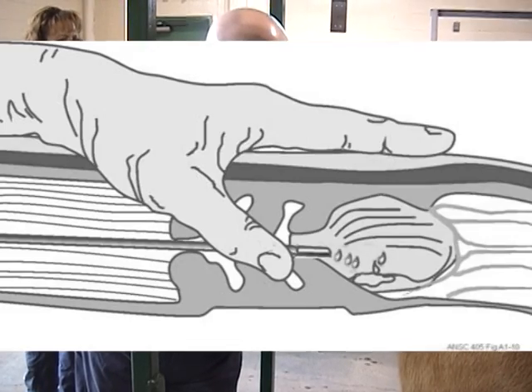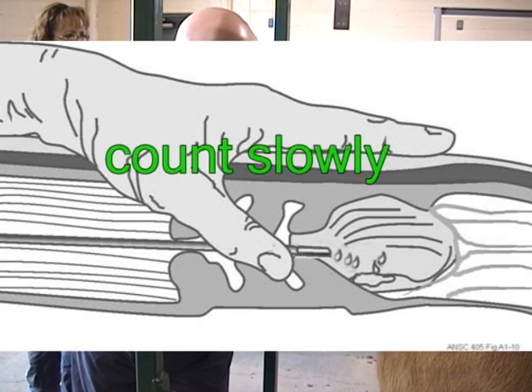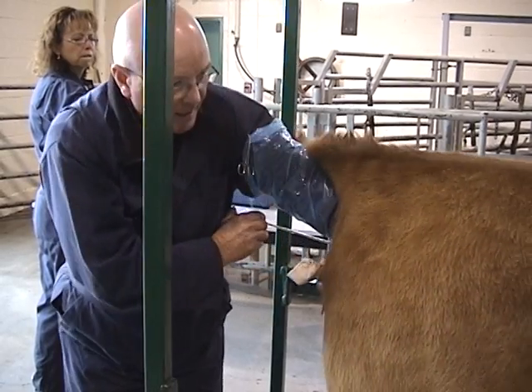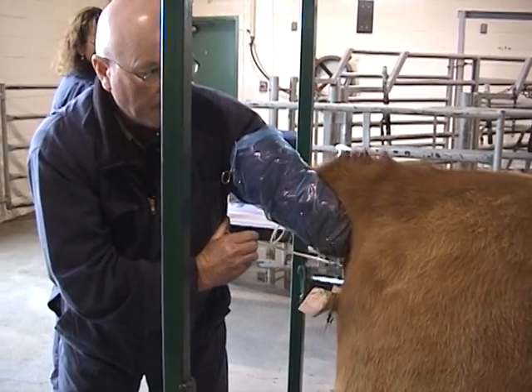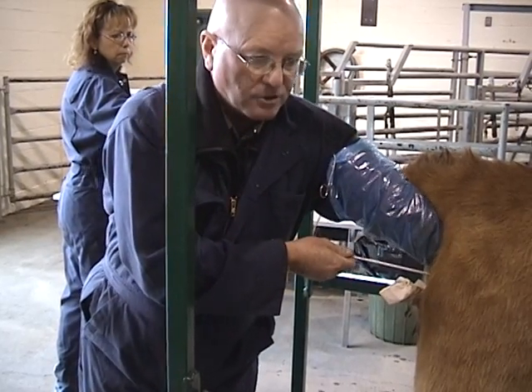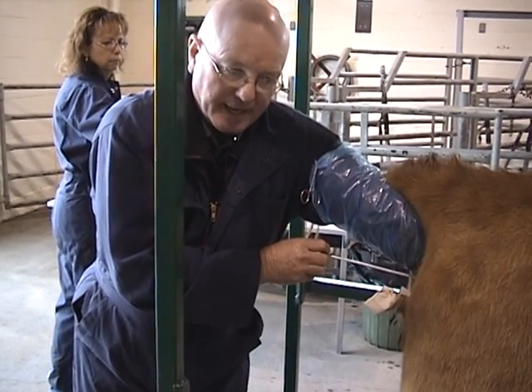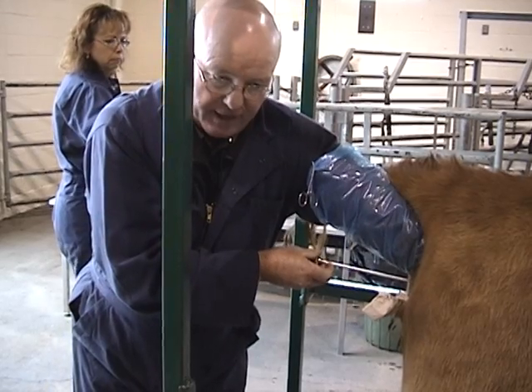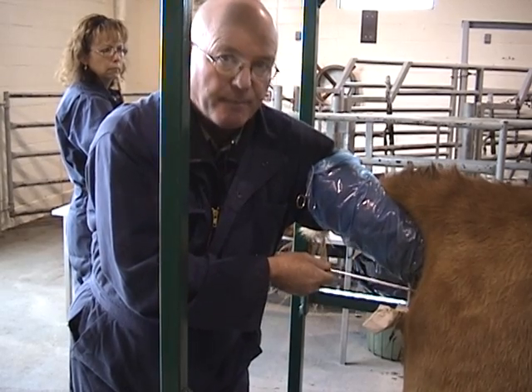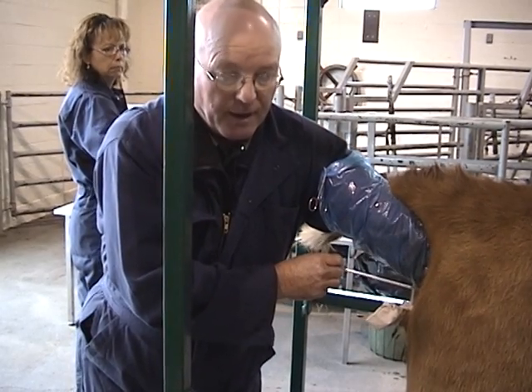I'm now going to inseminate — inoculate the semen into the body of the uterus. As you're inoculating, you want to count between five and seven. You want a slow, steady, even deposition of semen into the uterine body. If she kicks, belches, or shifts position as you're depressing the plunger, stop, stay with her, lean against her, let her settle back down, and then re-identify your rod tip. If you don't re-identify your rod tip, she only has to take a half a step back and you can be up the right horn. So re-identify, then continue to deposit the rest of the semen into the uterine body.